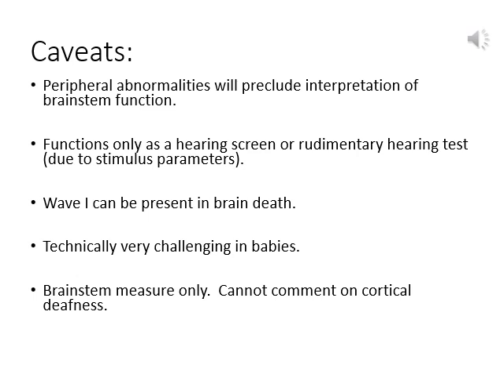The brainstem auditory evoked potential is very technically challenging to record in neonates, as it is a very small amplitude response and is therefore easily obscured by muscle or movement artifact. As well, in the baby, there might be blockages in the ear that degrade the quality of the stimulus that they are hearing. So it's absolutely important to see a wave 1 on the tracing before interpreting an abnormal or absent brainstem response.